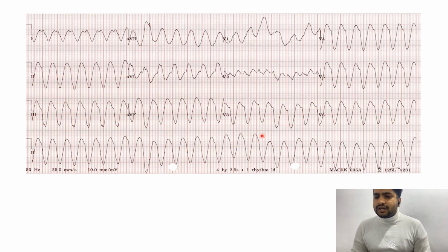Sometimes in pathological conditions, maybe irregularity of electrolytes or some other thing, what we see is 2 or 3 QRS complexes that look like ventricular tachycardia. We should not call any arrhythmia ventricular tachycardia unless it is more than 3 QRS complexes. If we have 2 QRS complexes that resemble VT, we call it a duplet. If there are 3, we call them triplets. If these QRS complexes persist for more than 3, then we start calling them VT.